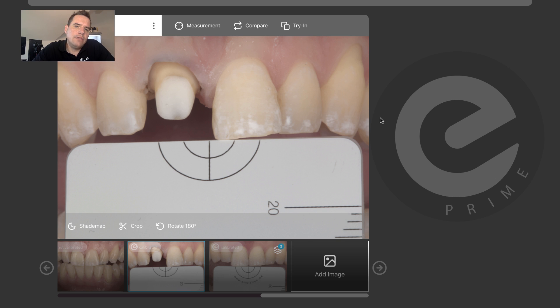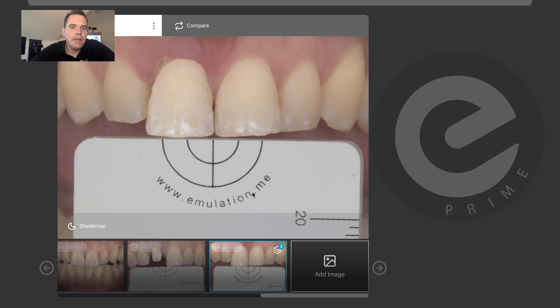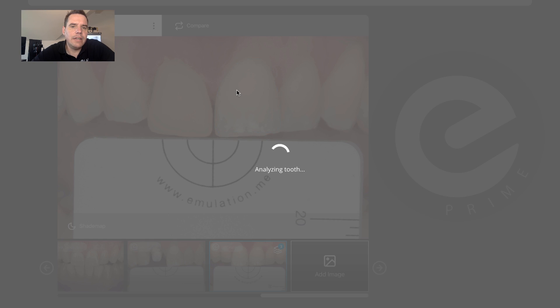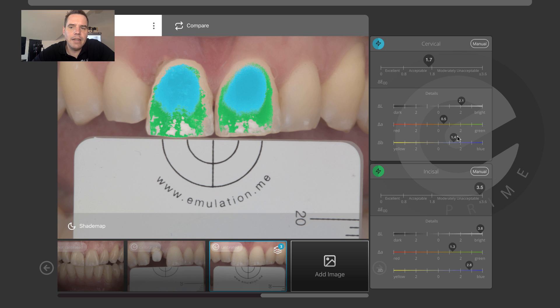One of the things you really have to look out for with this protocol is dehydration. Dehydration is the most common cause for complications when it comes to implementing the elab protocol into your daily workflow. With this particular case, we took a picture of the preparation just before they were taking the impression. You can already see quite strong signs of dehydration on the teeth. I did a digital try-in comparing the image taken with the provisional in place a few days later, and you can very nicely see the effects of dehydration — the luminosity increases and the yellow decreases. The teeth become less yellow and more blue as they dehydrate.